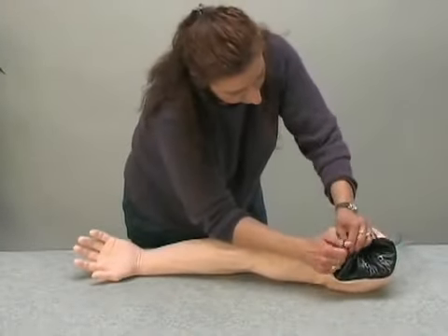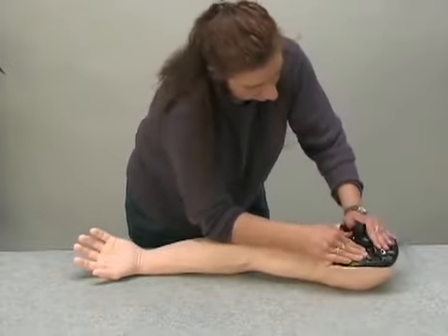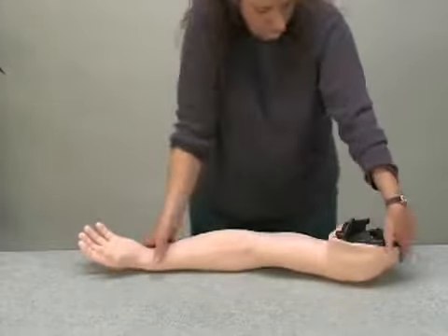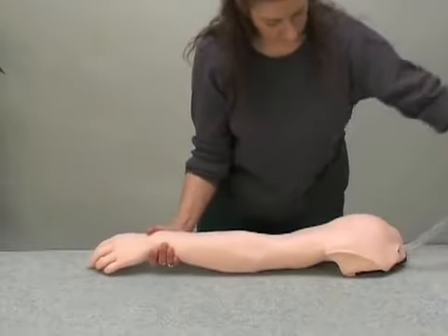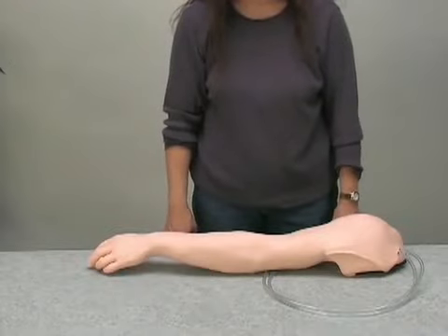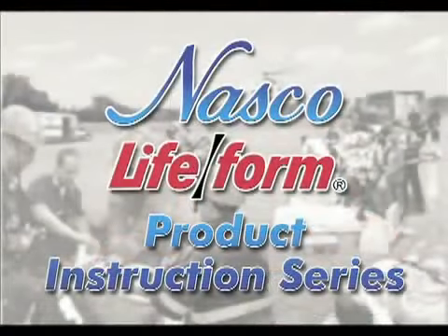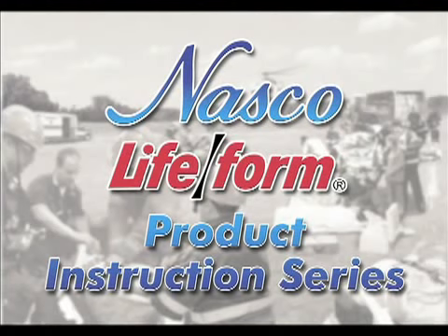Congratulations! You have replaced the skin and veins for the Nasco Lifeform Advanced Venipuncture and Injection Arm. If you have any additional questions, review the video, read the color-coded instruction manual, or contact your local Nasco distributor.